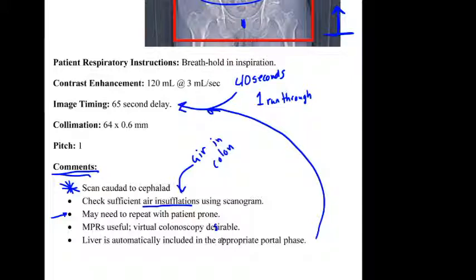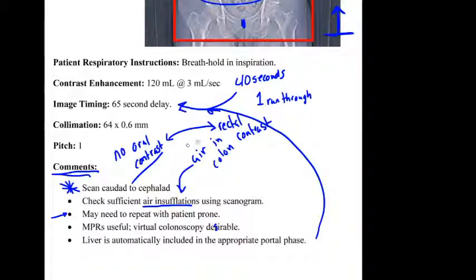The thing that makes virtual colonoscopy, endoscopy, colonoscopy, things like that work is that you have to have air inside the colon to actually inflate it. So you're not looking for oral contrast. But you're looking for something different. You're looking for rectal contrast. And not any type of rectal contrast, but you're looking for air.